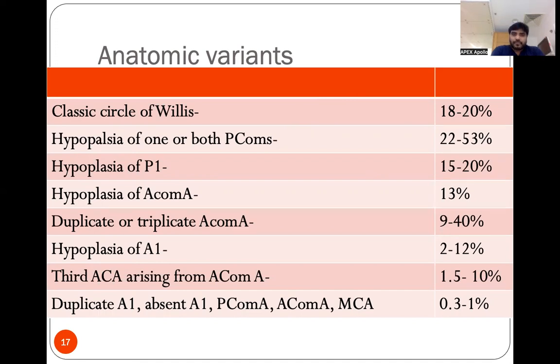So these variants may sometimes prevent identification of the vessels.